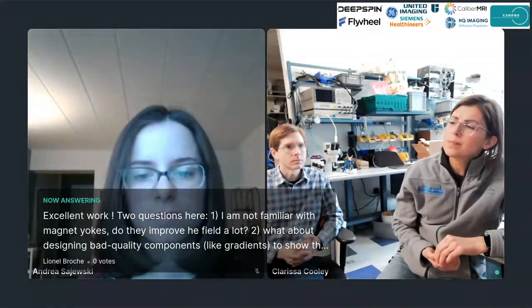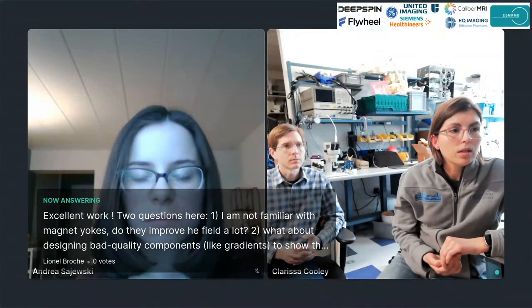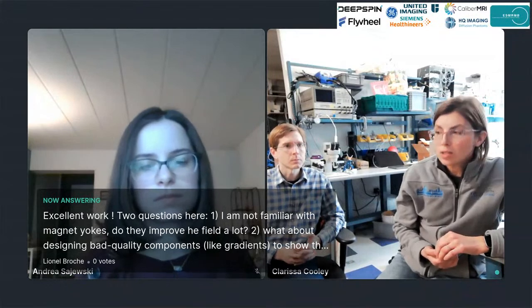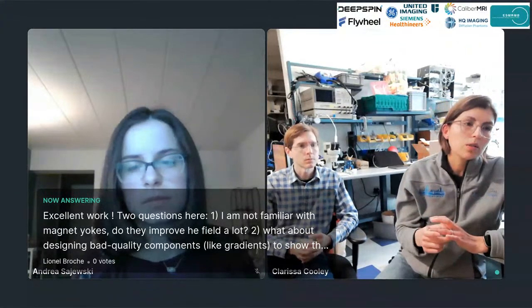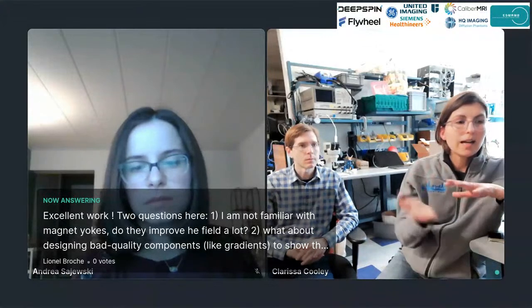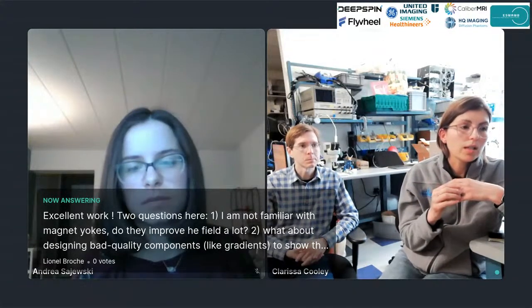I think it would be difficult to actually design this type of magnet without a yoke. The dimensions of the yoke factor into the magnet design and the homogeneity that can be achieved. The pole pieces also play a big role. There are iron pole pieces attached to the magnet faces, and those could also be optimized to shape the field and improve the homogeneity.